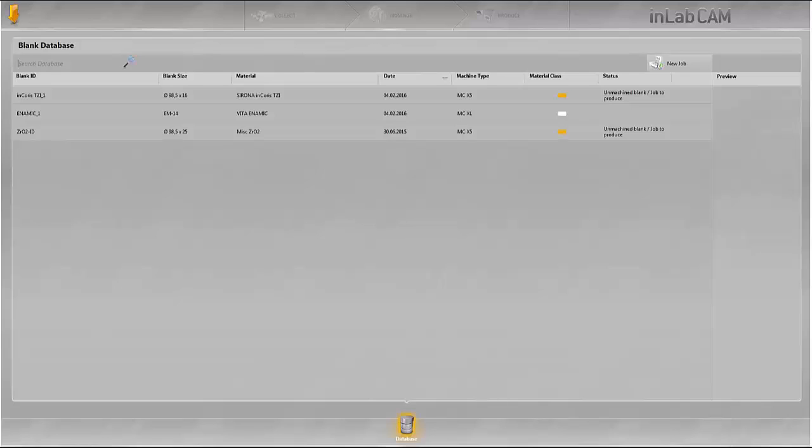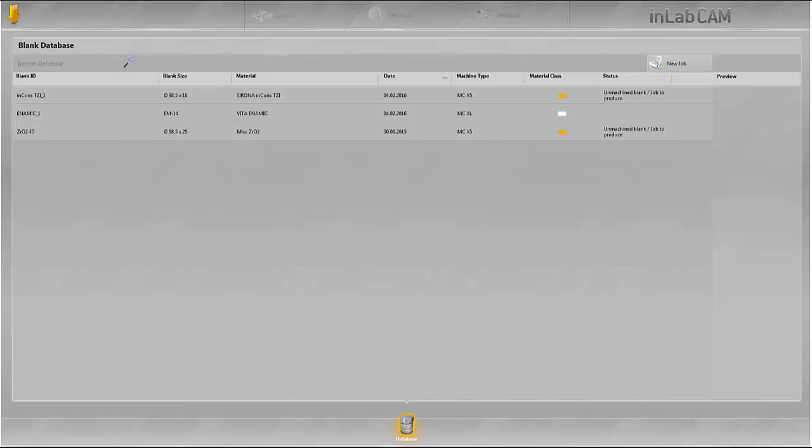It further explains how the imported design data with restorations from InLab software 15 can be processed together in a blank in the InLab MCX5.